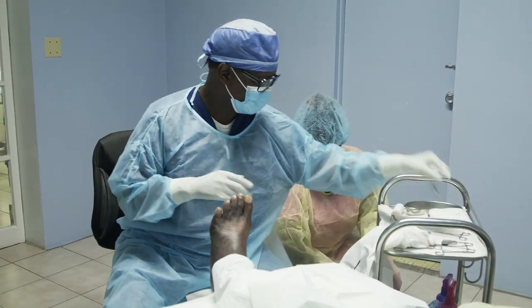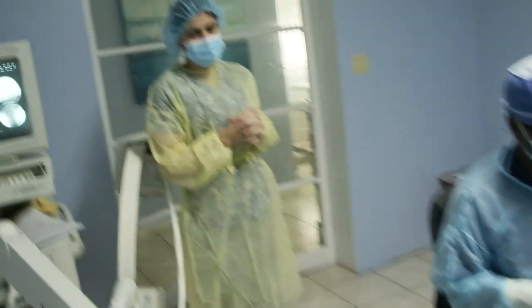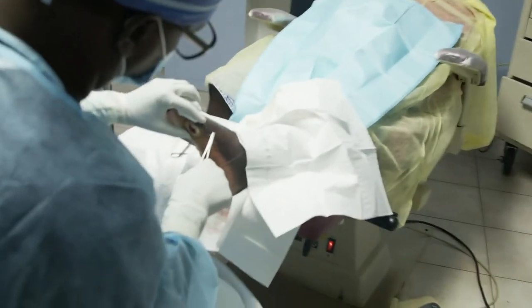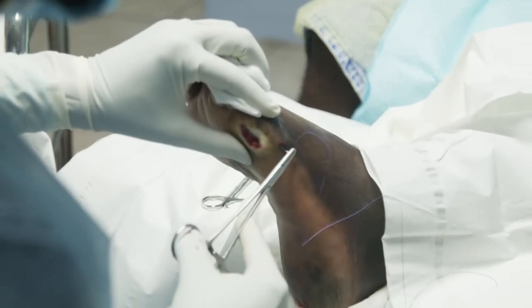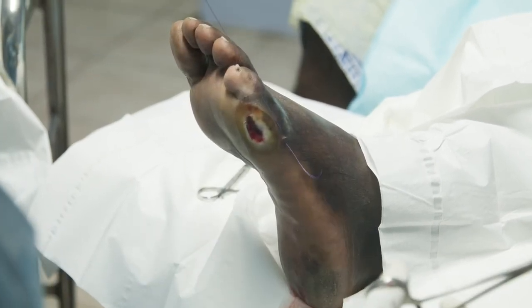Suture, right here, right, scissors, done. What do you think, Raleigh? Was all right? You good? Good, man. Thank you for letting us do your work. Pleasure and an honor to treat someone like you who's done so much for other people. So one stitch, boom, right into the joint, right around. Nice closure, little dab, and we got it.